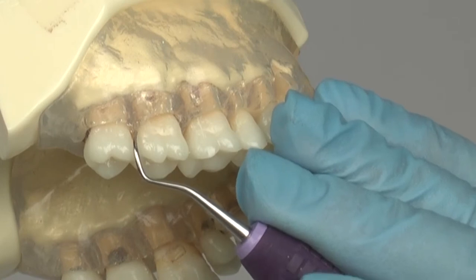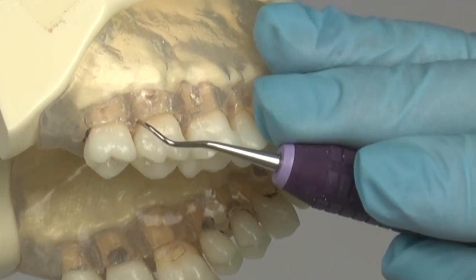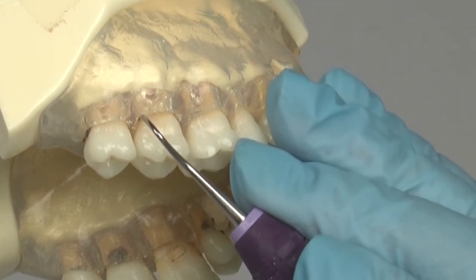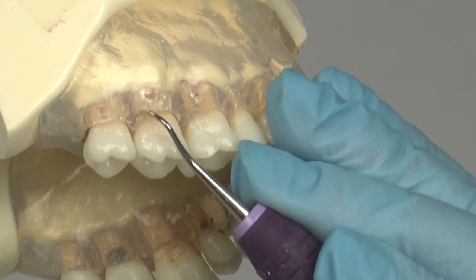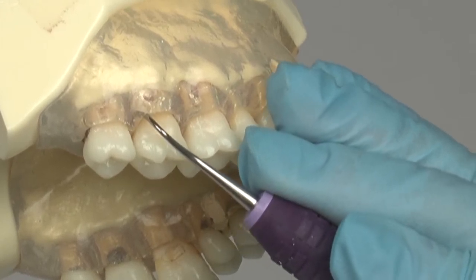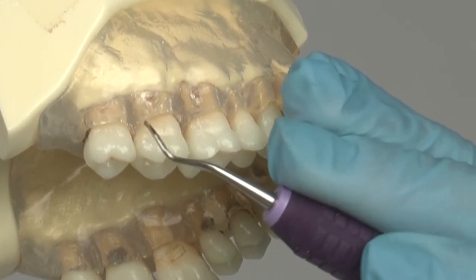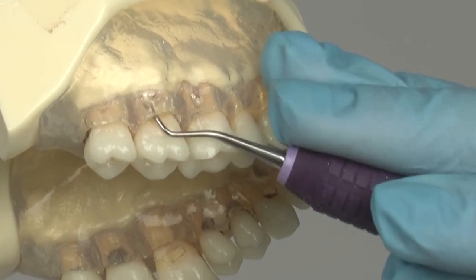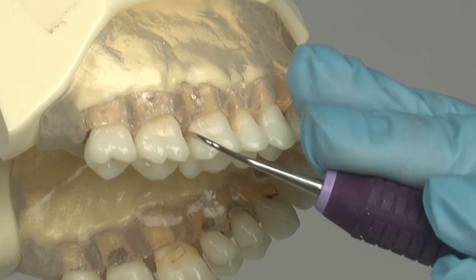When applied to each of the posterior teeth, the Columbia 1314 curette is inserted at a 0 to 40 degree angle and opened to 75 to 80 degrees to begin scaling. Begin at the distal line angle and scale the entire distal surface. Next, the opposite cutting edge is applied at the distal line angle with the toe forward. Scale with overlapping strokes across the buccal surface into the mesial surface.